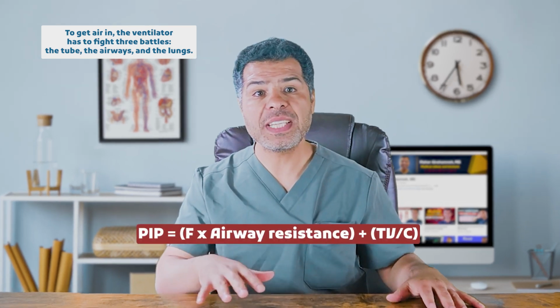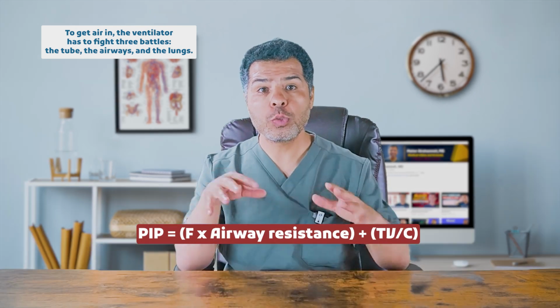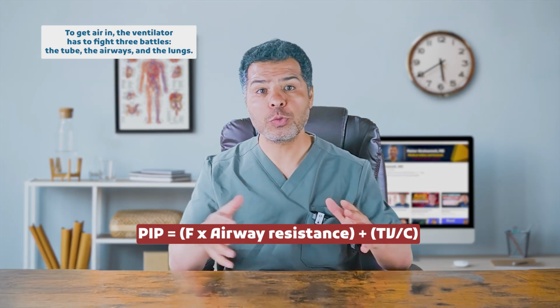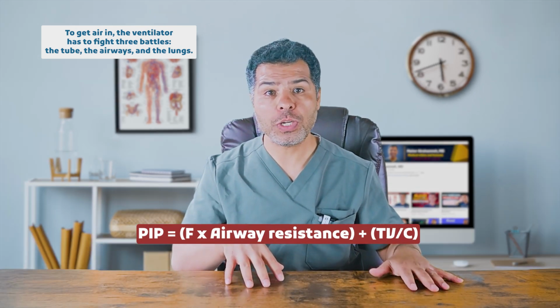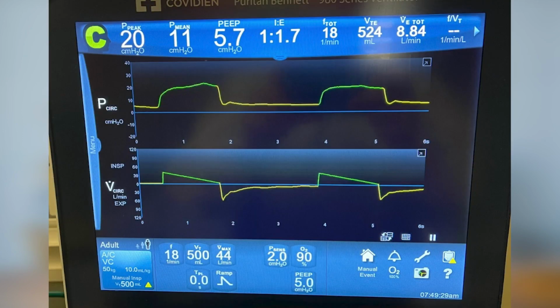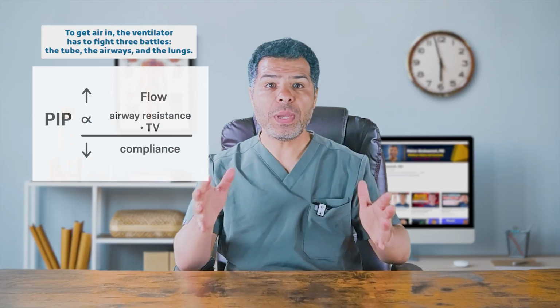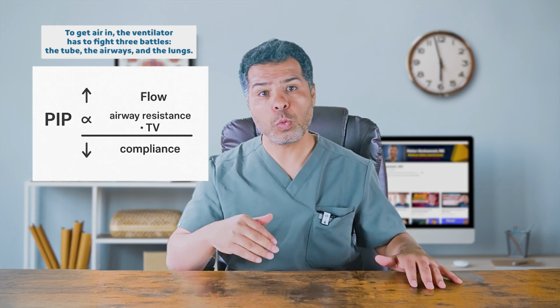This equation is the backbone of mechanical ventilation. Please keep it on your phone to come to it every time you try to troubleshoot peak inspiratory pressure or flow issues. Take a peek at this ventilator screen. The PIP here, peak inspiratory pressure, is 20 centimeter H2O. The flow rate is set to 44 liters per minute and the tidal volume 500 ml. Guess what will happen to the PIP if I increase either the flow or the tidal volume? So based on the equation, the peak inspiratory pressure will go up, correct?